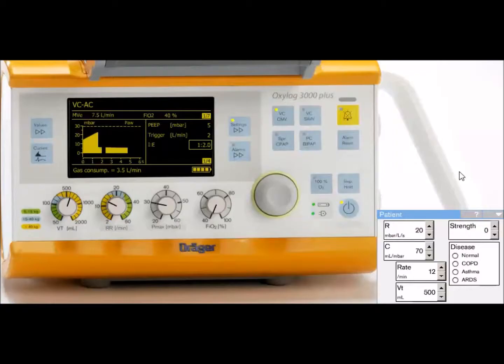Does volume control CMV with dual targeting allow for the manual adjustment of minute ventilation parameters, and is there any automatic adjustment behind the scenes of support in response to changing respiratory system mechanics? Now, as you can see, I do have my set points of respiratory rate and tidal volume, and that allows for me to change my minute ventilation parameters quite easily. Right up front, the operator can do this. So nothing new here.